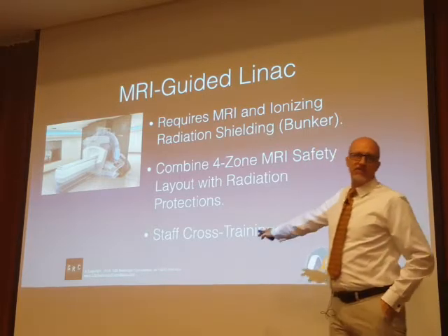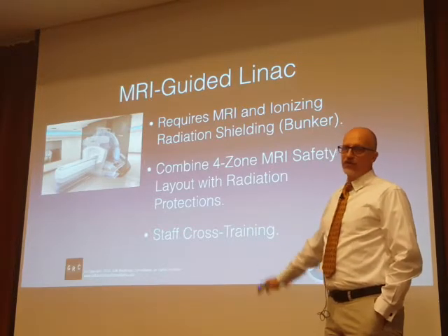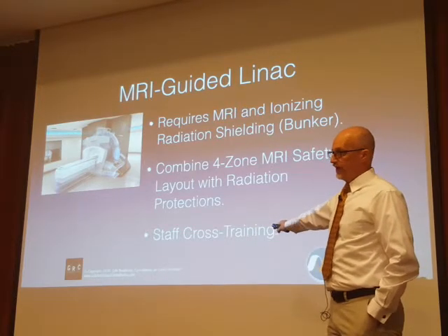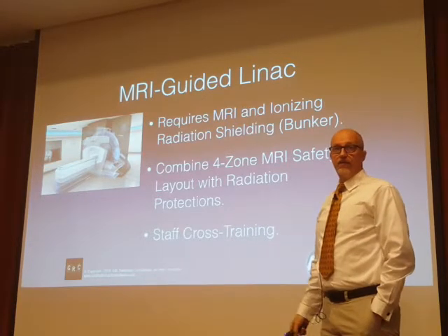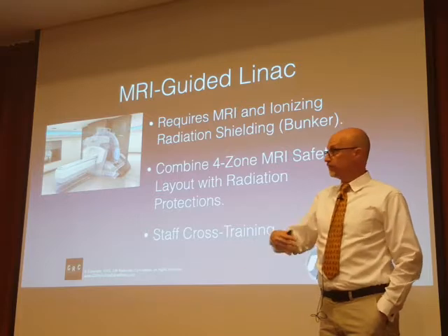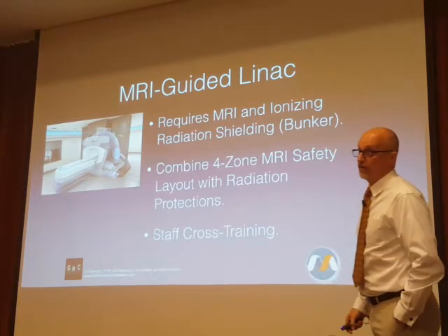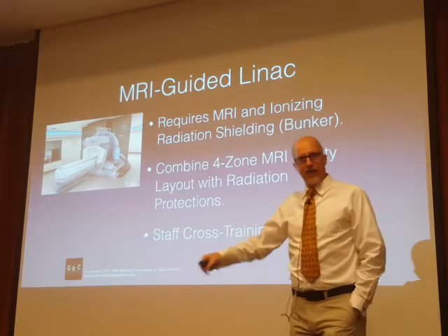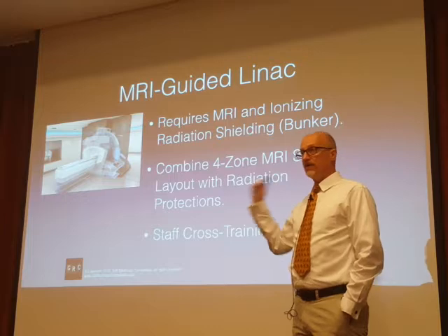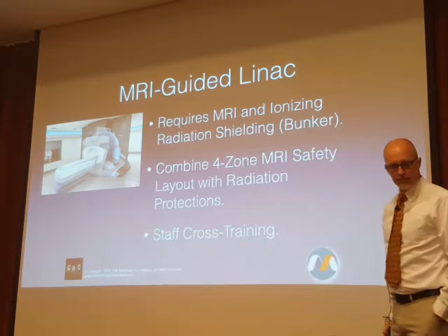And then again, we have staff cross-training because the oncology therapy techs who run linear accelerators generally don't know anything about MRI, and MRI radiographers don't know anything about linear accelerators and beam therapy. So again, making sure that clinical and safety competencies are effectively cross-trained is really important.